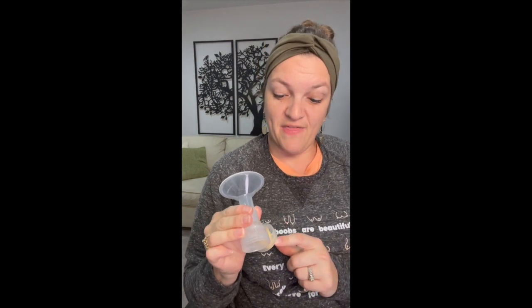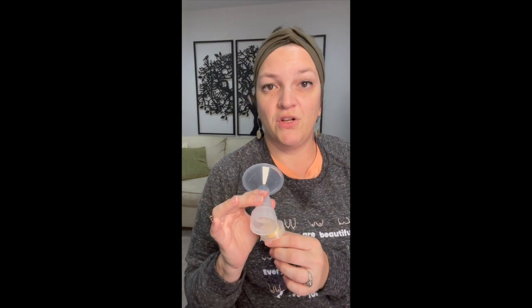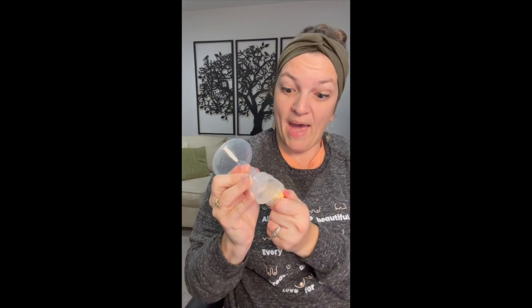If you're leaning forward trying to pump milk and the valve is leaning back, you may actually create too much suction inside that membrane, which can then cause the milk to back up through the system and then come out through the flow protector and down your tubing. So if you're noticing that you're starting to back up milk and it's getting into your tubing, it may be because you have this positioned where it's creating too much suction. That also happens if you have it facing backwards. So when you have it facing away from your body, if you're leaning back, it may cause this membrane to create too much suction where that milk can't empty out of this valve. So then it's going to back up into the tunnel and eventually get into your tubing.